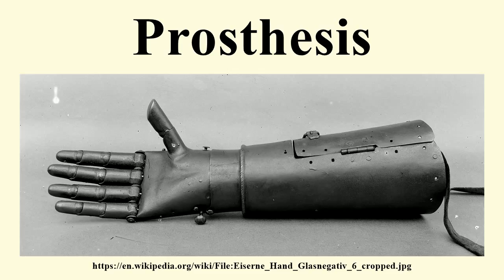These include hip disarticulation, transfemoral prosthesis, knee disarticulation, transtibial prosthesis, Syme amputation, foot, partial foot, and toe. The two main subcategories of lower extremity prosthetic devices are transtibial and transfemoral. A transfemoral prosthesis is an artificial limb that replaces a leg missing above the knee. Transfemoral amputees can have a very difficult time regaining normal movement. In general, a transfemoral amputee must use approximately 80% more energy to walk than a person with two whole legs. This is due to the complexities in movement associated with the knee.